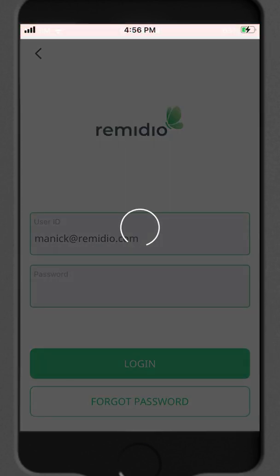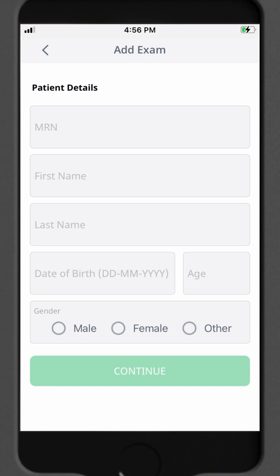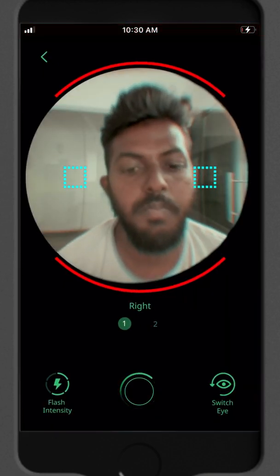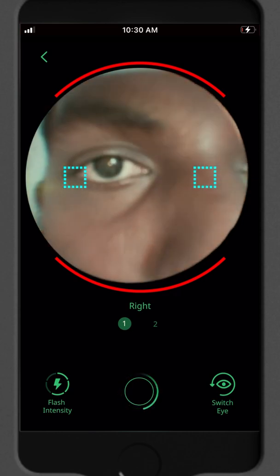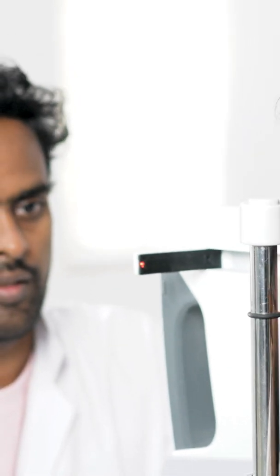Sign in to the app with your ID. Create a patient folder and enter the patient details. Entering patient history is also possible here but it's optional. Then tap on add exam and the capture screen will open. Ask the patient to look at the red fixation light. The position of this light will change as the exam progresses, so make sure that the patient looks at it.